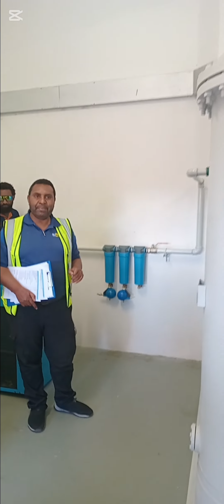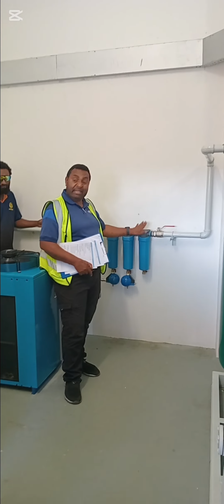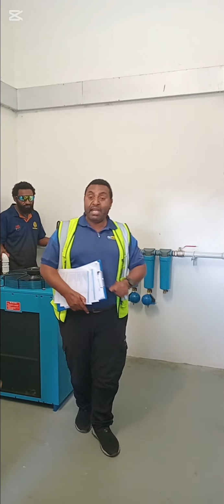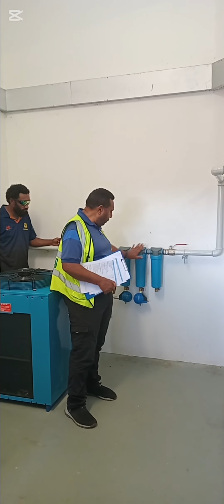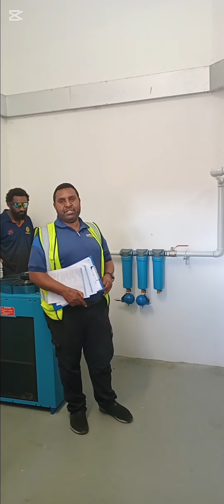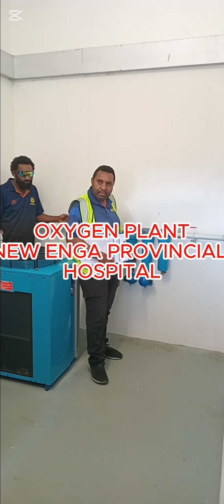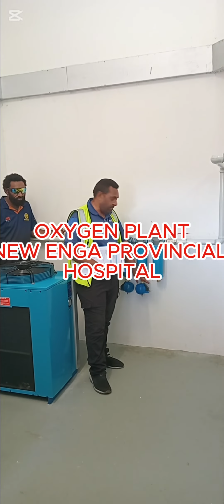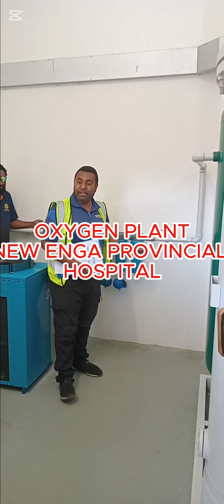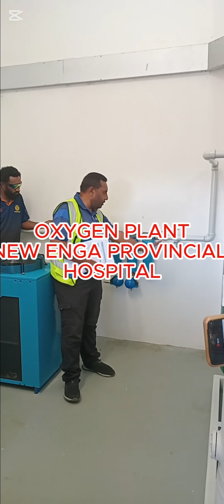Then there are some filters here. In a normal setup, you will see only one. The best practice is two, but not a third one. But here, I decided to add the third one because we really needed to filter out any unwanted contaminants and dust. This is the fine filtration for any water. In this line, most water is captured in this filter. When we open it after maybe one year in operation, you might find some liquid. This one, nil. These are called micron filters. If you have worked with filters, you would know. Micron is a very minute filter step, for dust and collection. So that's how the filtration process works for the air.